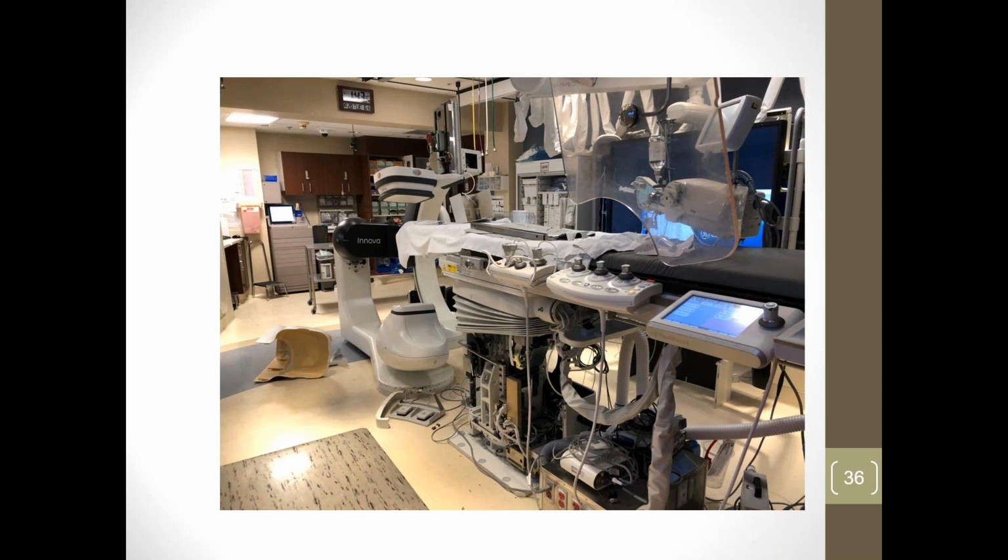Unfortunately, we went down the wrong rabbit hole, and we figured it was something within the system out here. It was actually in the positioner cabinet. A bad power supply took out the table, and then one of the positioner cards took out the image intensifier, the image detector, and the SID function. So it took us a while to figure it out, but once we got those fixed, then the system was working again. But it was kind of neat to look at it with the covers off and see all the stuff hiding back behind things.